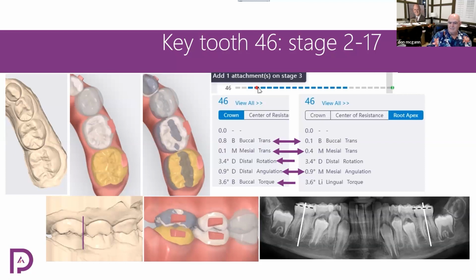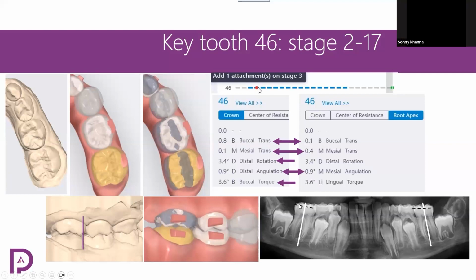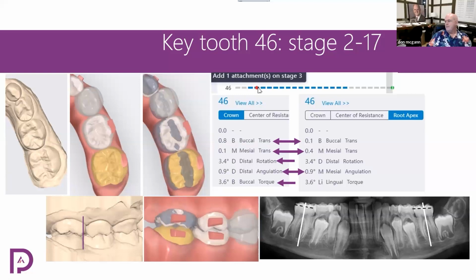Okay, but are we fixing this class 2 mixed dentition? Look here, no. And also look here about the uprighting, lower molar tip back. How do you do that? Utility arch, right? That's about the only thing you got. The rest of it is just hold it with a lower lingual arch, or in our bands, we do have UP or C2E that'll upright those lower molars.